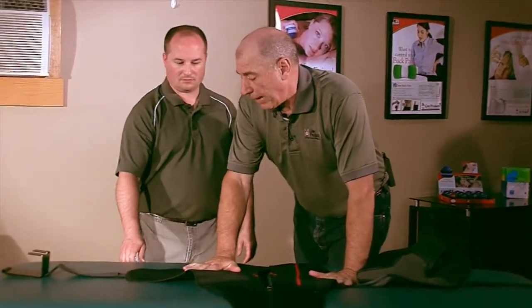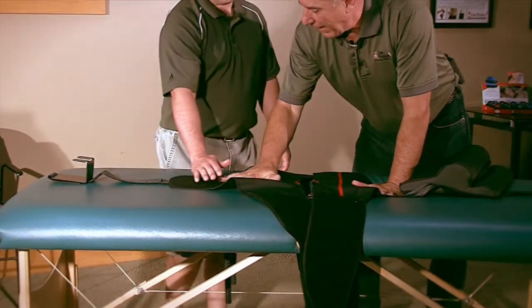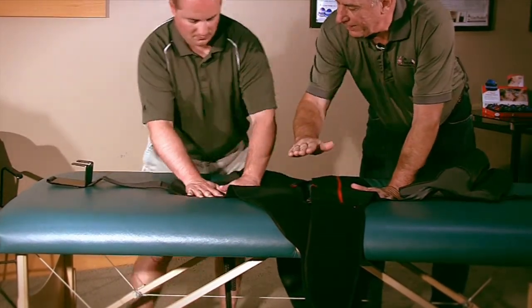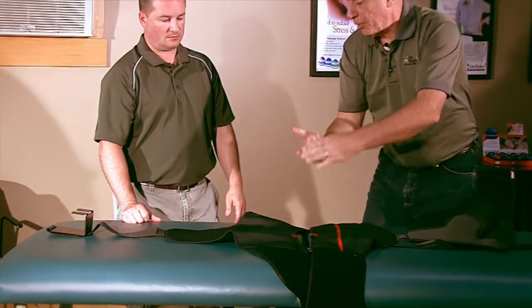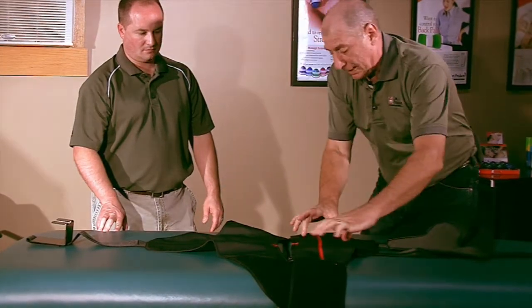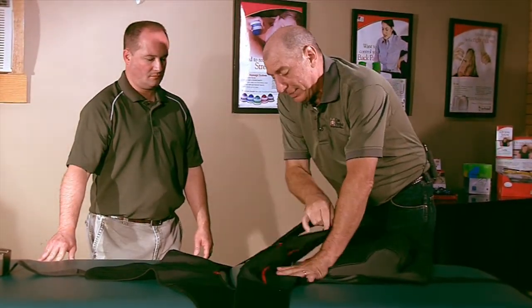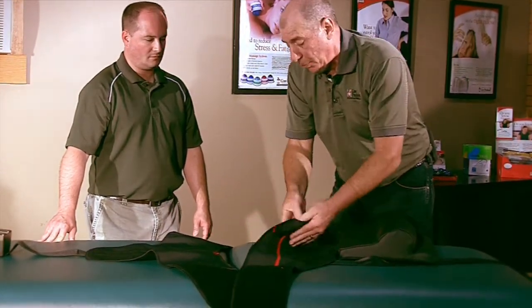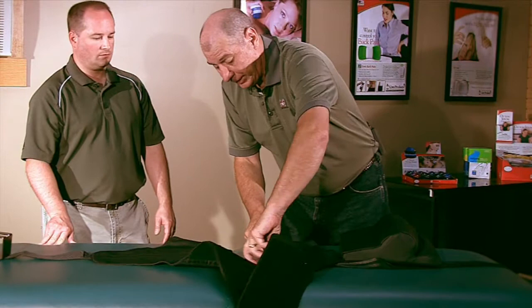So a couple of things we've got, and you mentioned the slippage part. This material — if you don't mind, just put a little downward force and try and slip this material in a direction. This is trying to adhere to the table, and that same material is adhering to the patient. So when we get them buckled up, this material does not let them slip. The same thing here — when this is attached to the patient, this is wanting to grab them, but this side is free to slide on the table. So as far as slippage, we have addressed that, and it's really with the materials that we're using.